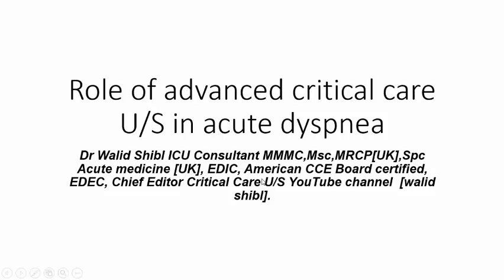Today, we'll talk about the role of advanced critical care ultrasound in acute dyspnea. Really, it is magic. And we will learn in this project a step-by-step approach for a case of acute dyspnea by advanced critical care ultrasound.